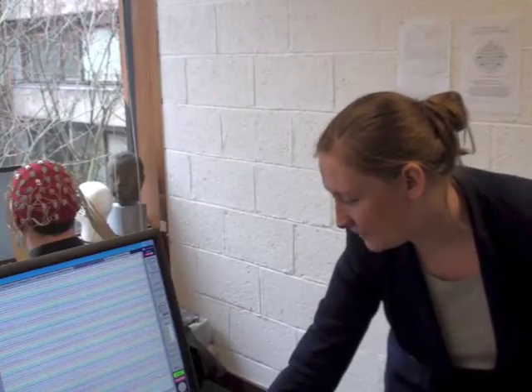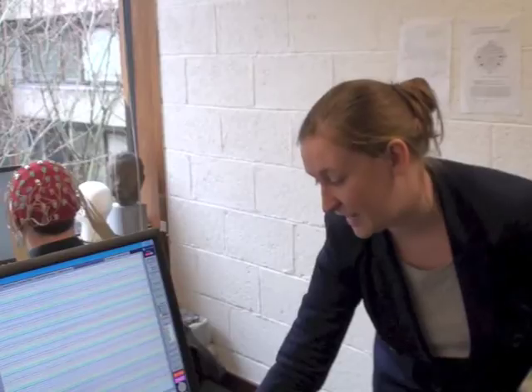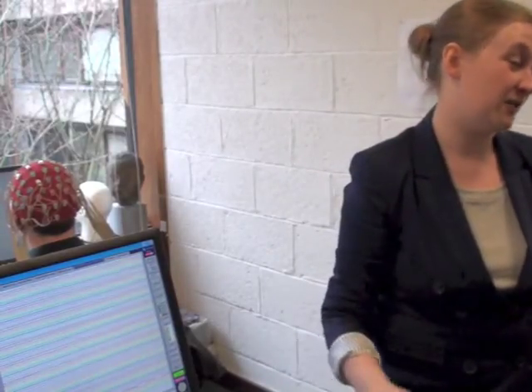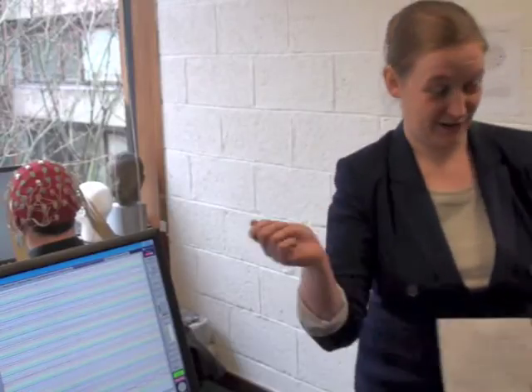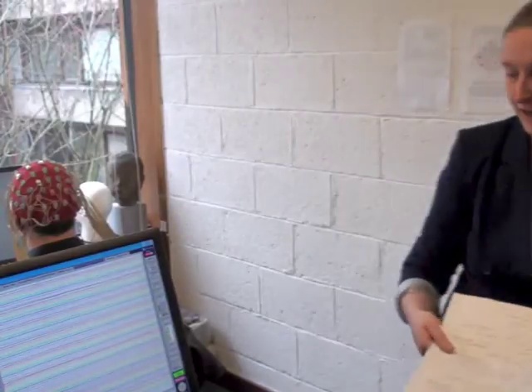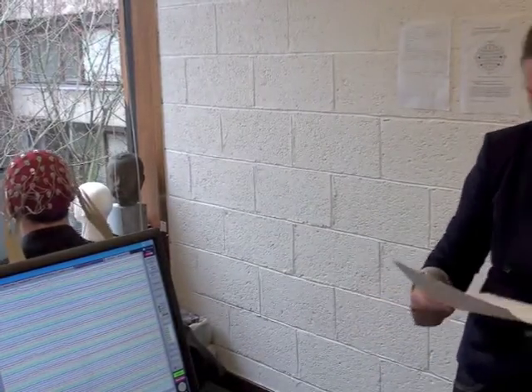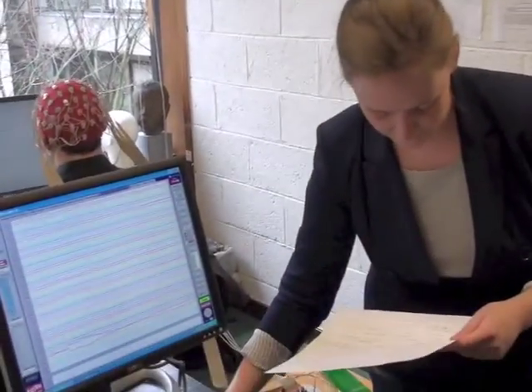If something's going terribly wrong and I need to pause it, I can pause the save and then later on continue saving. I would never use that. If something's going wrong in the middle of a block, the whole block is usually lost. You'd have to go back and fix things and start a new block, okay? It never really works that it just fixes itself, not least because the program is not going to be in sync with the presentation anymore.